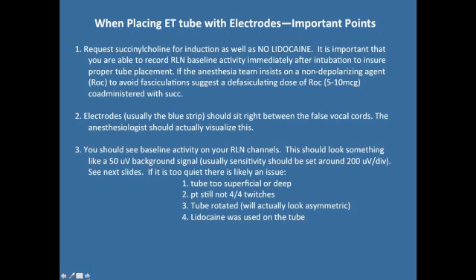Recording left and right, especially on a thyroid, this is absolutely essential. For an ACDF, this would be nice as well. However, if you need your channels for more muscle coverage, it's okay to reference left and right. You don't have to do a bipolar recording. So do bipolar whenever you can. Do bipolar always on a thyroid or a parathyroid, and then reference only as needed. That's the answer to that.